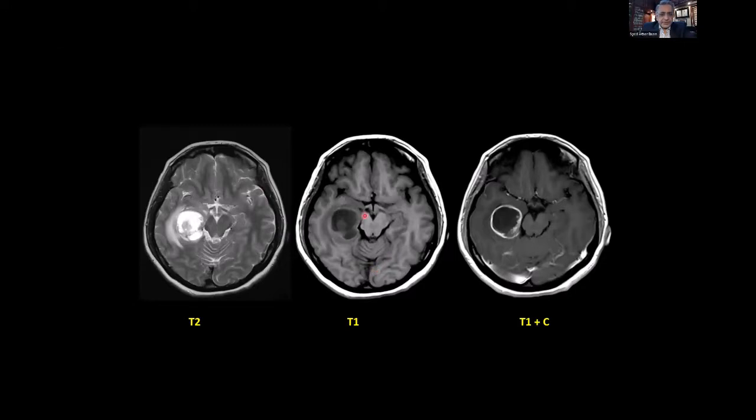So the difference between T1 and T2 is this, remember: the white matter is white in T1, whereas the gray matter is white in T2, right? So this is white matter, this is gray matter. You see, this is whiter and this is grayer, whereas here it's the opposite. In MRI, we don't say dense, we say intense. Although both are sort of isointense, this is relatively hyperintense compared to the cortex, which is relatively hypointense. And in T2, the white matter is hypointense compared to the gray matter, which is relatively hyperintense.